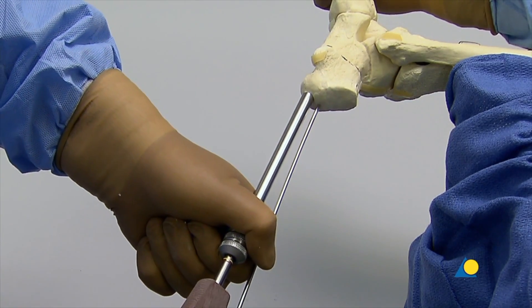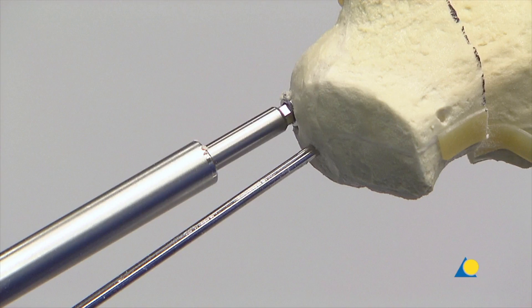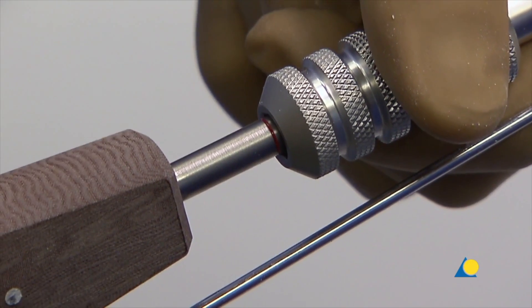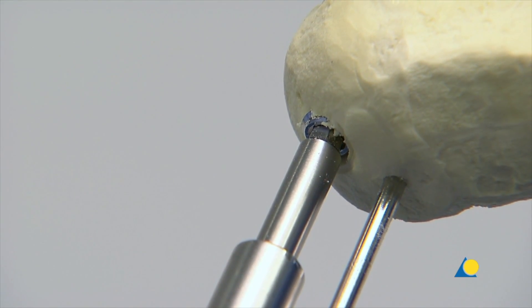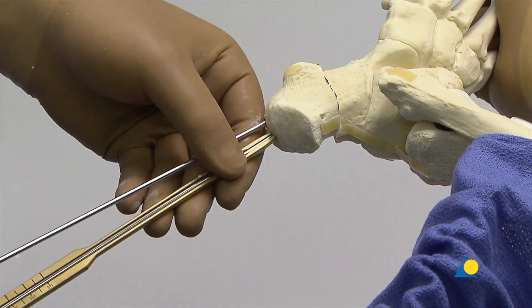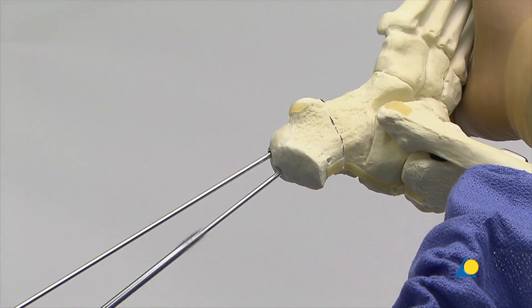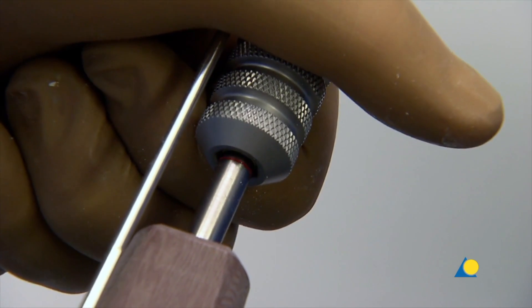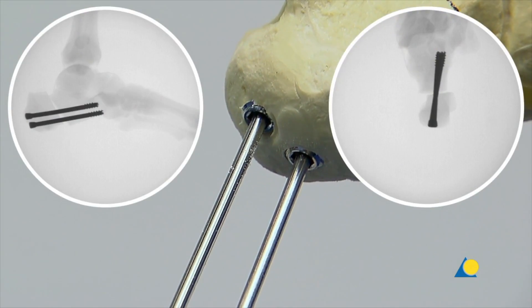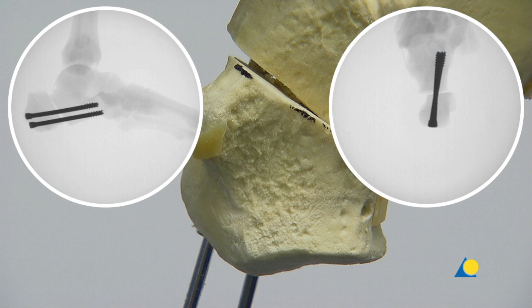The head of the first screw is advanced until it is 2 mm below the bone surface. A second screw is inserted using the same procedure. However, this screw is advanced only until it is flush with the bone surface. The image intensifier is used to check the position of the screws. If the final tightening is performed without the compression sleeve, image intensification will confirm the correct position of the screw head.